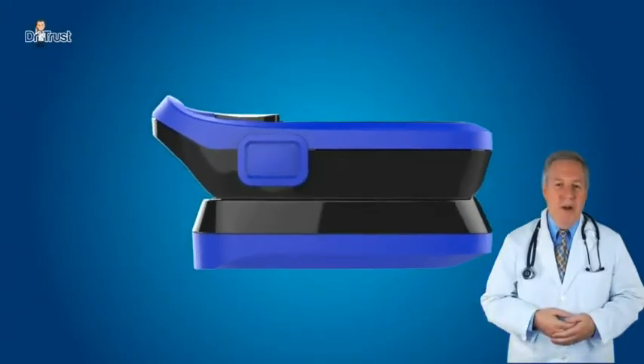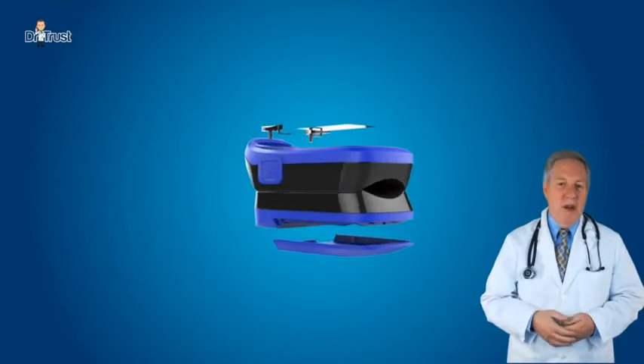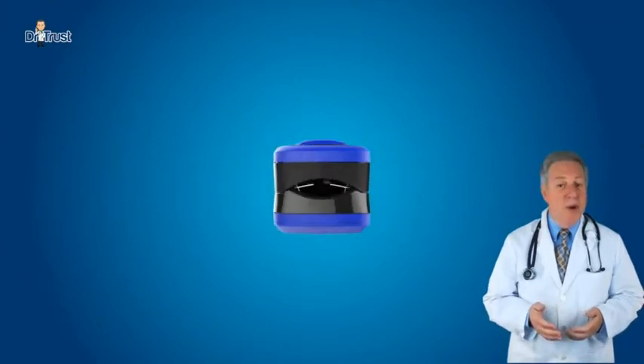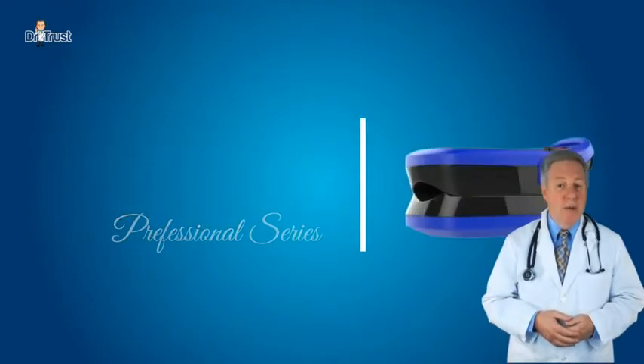Dr. Trust USA Professional Series Fingertip Pulse Oximeter is based on all digital technology and is intended for non-invasive spot check measurement of functional oxygen saturation of arterial hemoglobin.